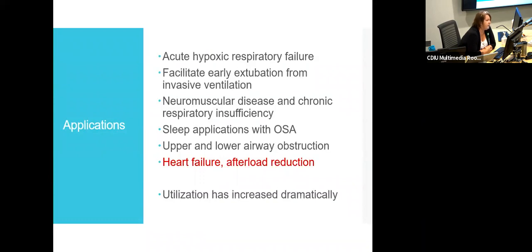This is a huge application and big business for home care companies and respiratory companies. How we have to translate that to provide this kind of therapy to children is interesting, because we really need to adapt what we're doing and understand some of the pitfalls of using adult devices on children.